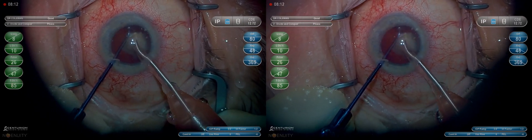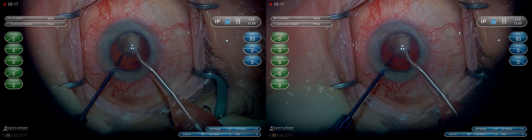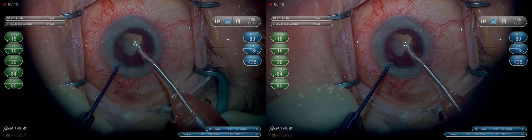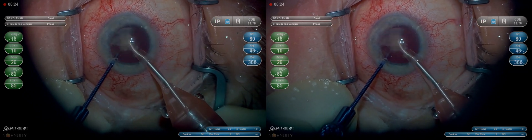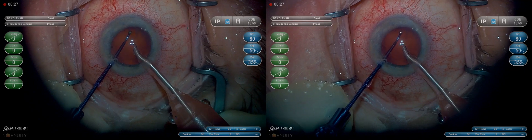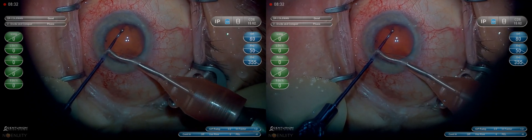You can see this is a very dense lens even with the MyLoop. The CDE is getting up around 16 before the case is done. You can safely say that without the MyLoop it would be in the 20s at least. I believe the MyLoop probably takes about five off of your CDE on any given case with a very dense lens.